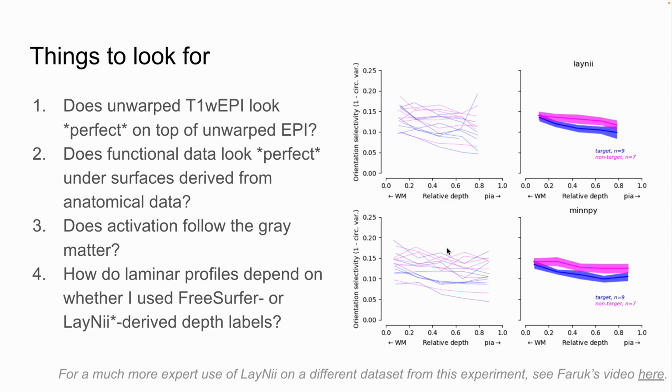And so any shape I see here, and some things do pass t-tests, and I do have a higher orientation selectivity in deeper layers than in middle layers, is completely an artifact of the noise structure of my data. So that's good. I did science, but really not the kind of science that I wanted to do. I have utterly failed to discover any kind of orientation selectivity in this data set. So I'm not even sharing with you the regressors for the orientation or all the task data, because it's going to be a challenge to get that paper out the door.